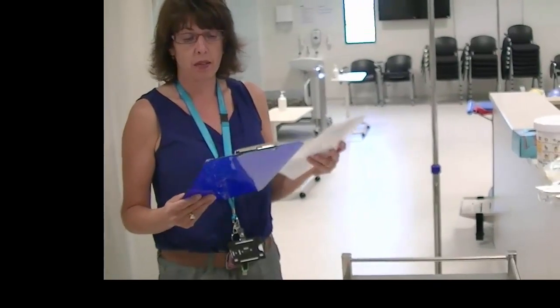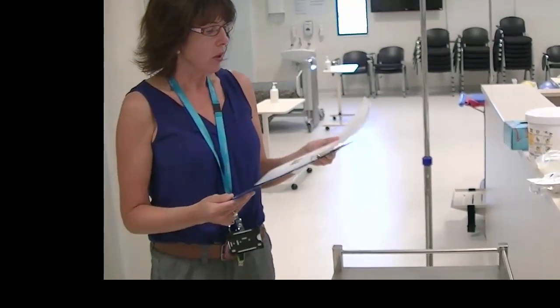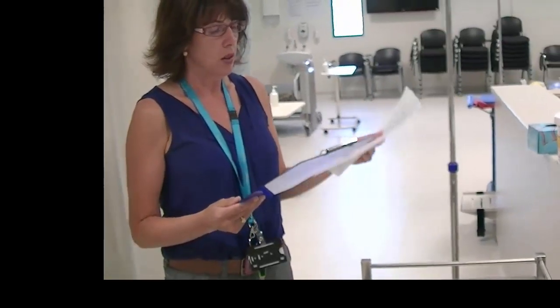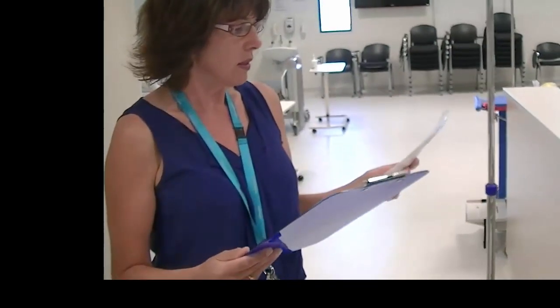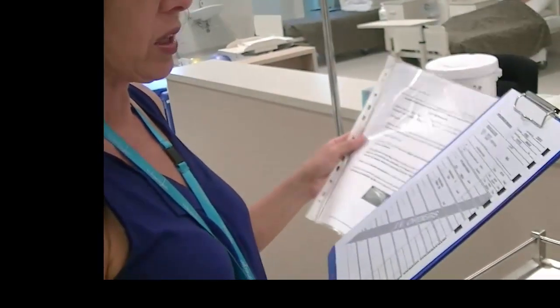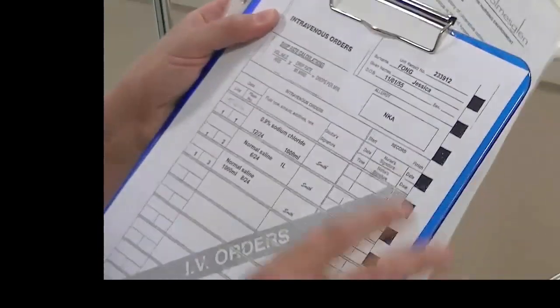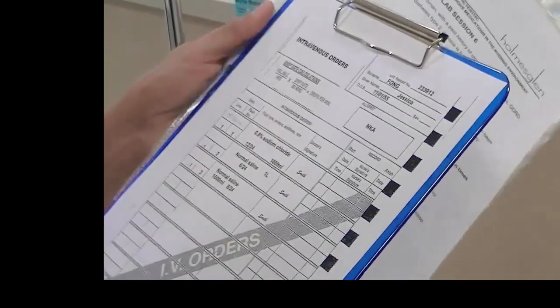Today we're going to prime an IV line and connect it to a patient. To begin with, I need to make sure I've got a scenario that corresponds with an IV chart. So this is for Jessica Fong. She needs an IV line for antibiotic therapy, and I've just checked that I have actually got Jessica Fong's IV order. Later on I will check her ID to her at the bed.